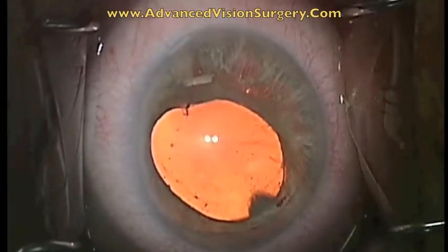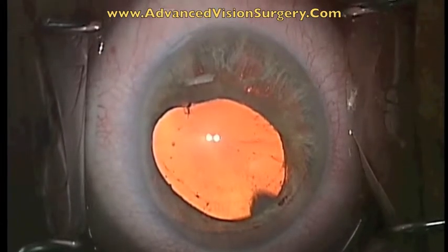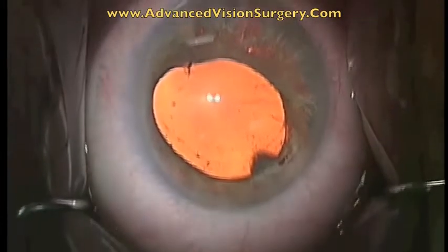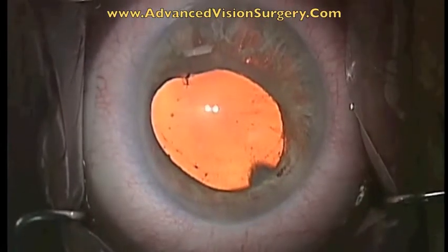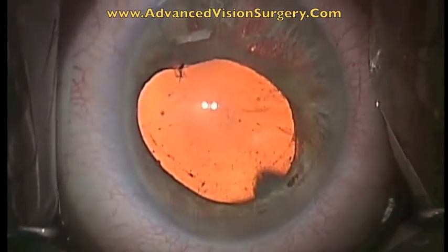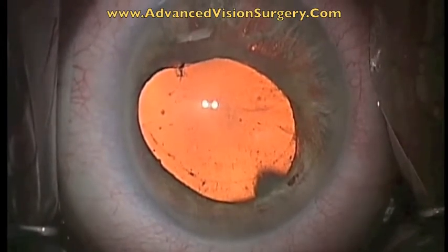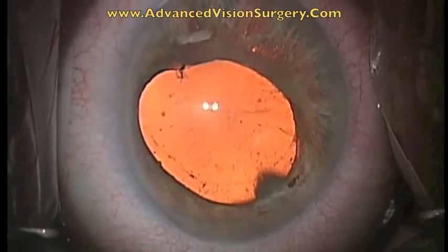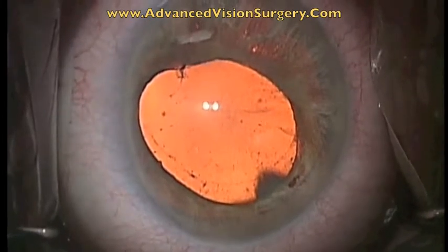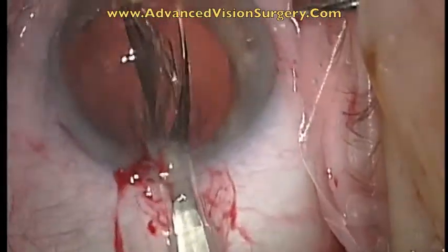This is a case of cataract and iris transillumination caused by long-standing inflammation due to Fuchs' heterochromic cyclitis. This patient had episodes of inflammation starting in the 1970s and now presented with a cataract and intractable glare.